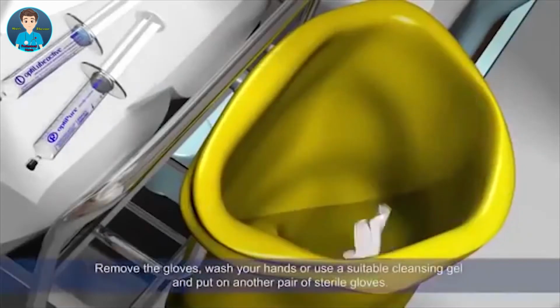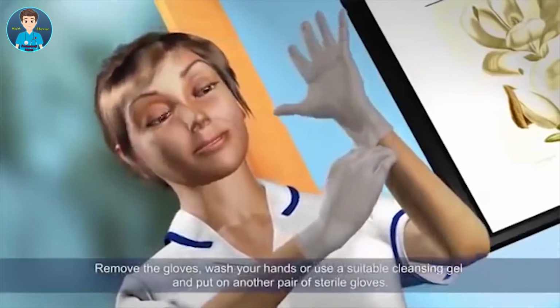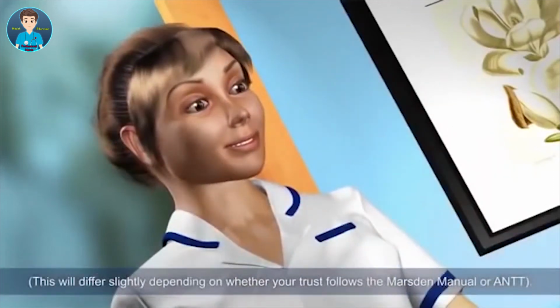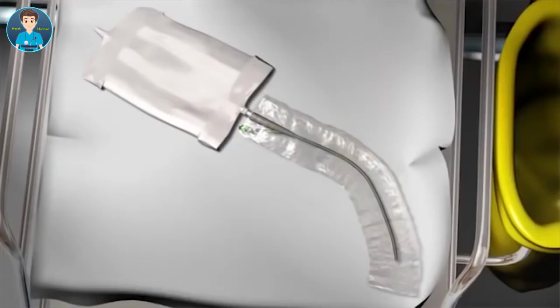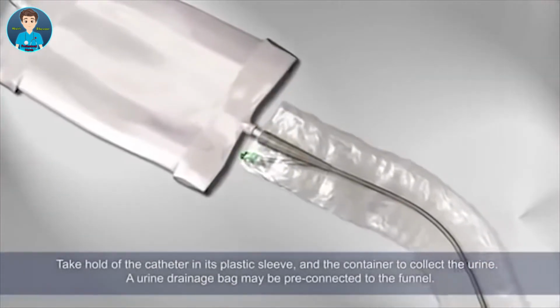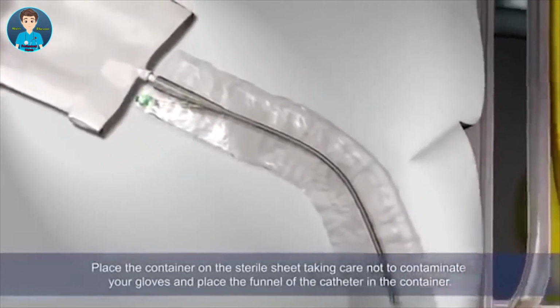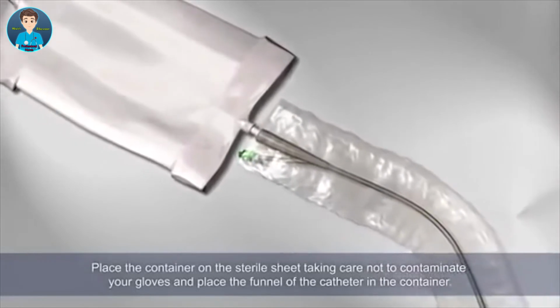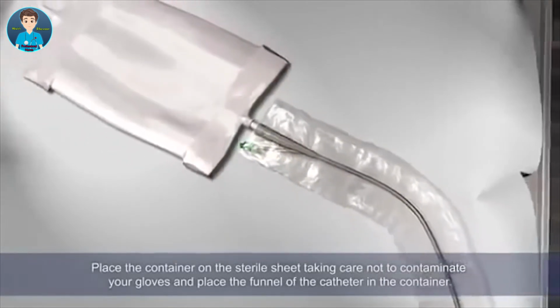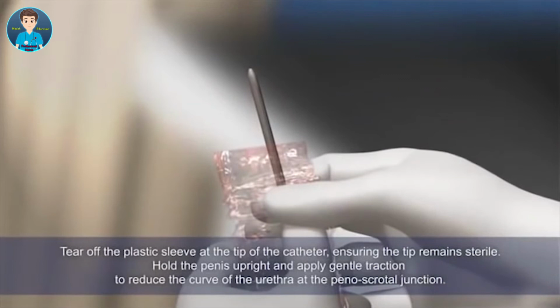Remove the gloves. Wash your hands or use a suitable cleansing gel and put on another pair of sterile gloves. This will differ slightly depending on whether your trust follows the Marsden Manual or ANTT. Take hold of the catheter in its plastic sleeve and the container to collect the urine. A urine drainage bag may be pre-connected to the funnel. Place the container on the sterile sheet, taking care not to contaminate your gloves, and place the funnel of the catheter in the container. Tear off the plastic sleeve at the tip of the catheter, ensuring the tip remains sterile.